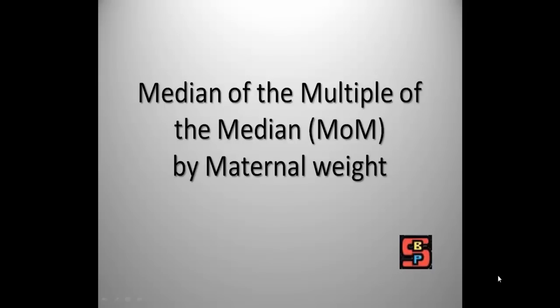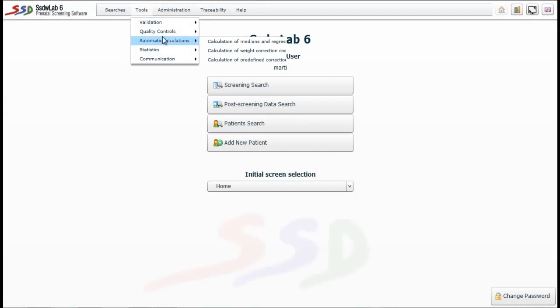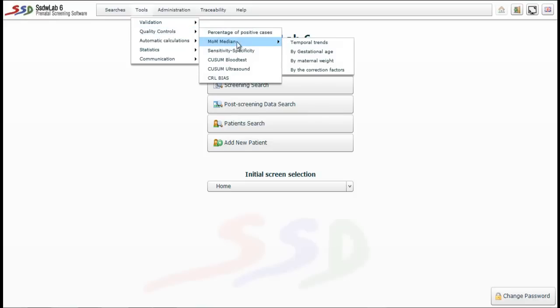Now we analyze the median of multiples of the median by maternal weight. We go back to the Tools menu and select the option Quality Controls, then Median MoM by Maternal Weight. The parameters defining our query appear on the left side of the screen.